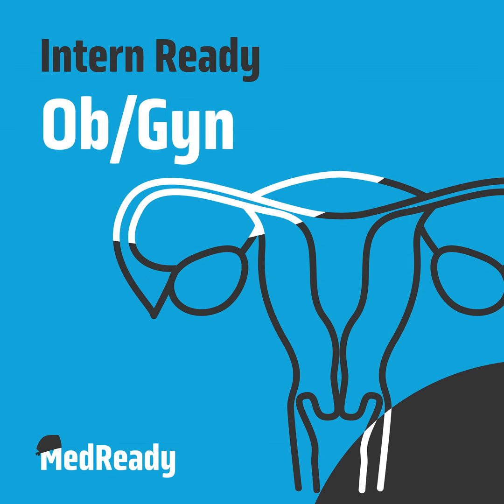Yeah, exactly. Some attendings will have you dilate with the mechanical dilators. Some of them will, in a hysteroscopy, just ask you to dilate with the fluid. And so you'll actually just place the hysteroscope and then open up your fluid and hydrodilate, where you'll use the pressure of the fluid to slowly dilate the cervix. And a lot of attendings like that because it gives you a little bit more visualization. Of course, if you were to perf with any kind of energy, that is a lot more of a serious complication, one in which you likely have to do some kind of laparoscopy to rule out bowel injury.